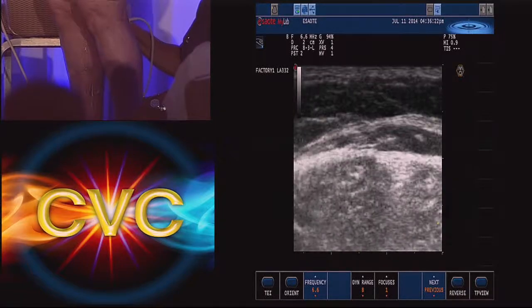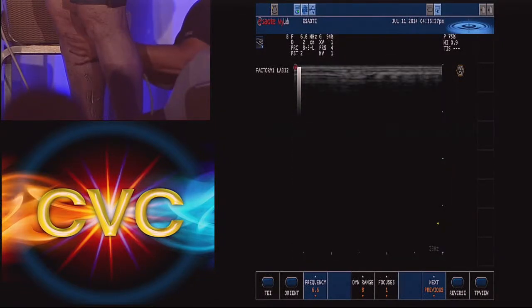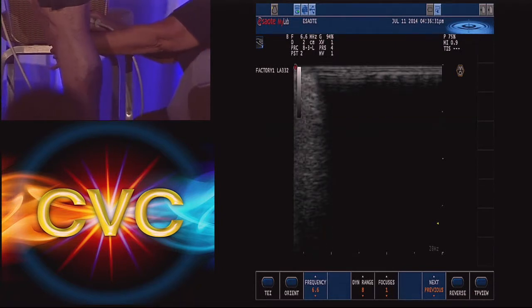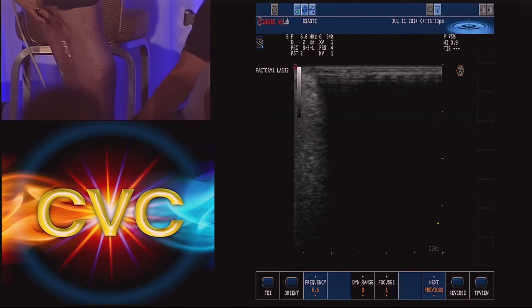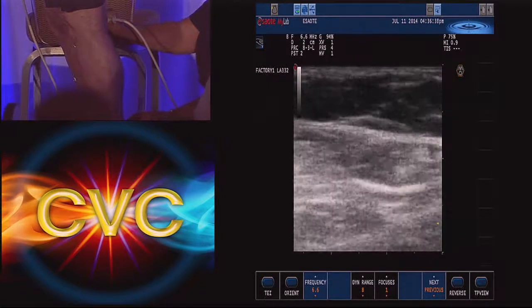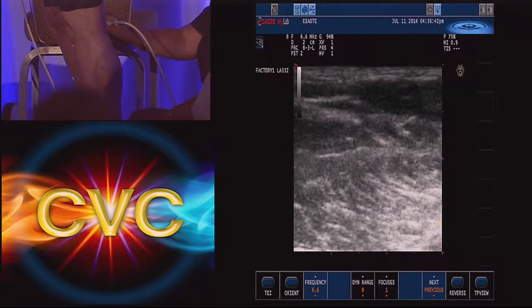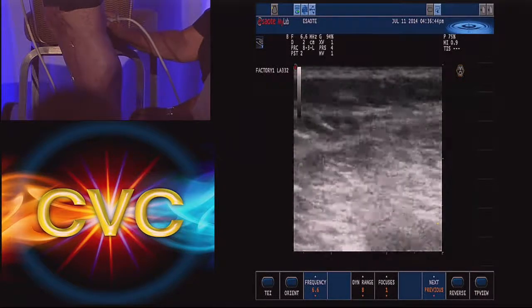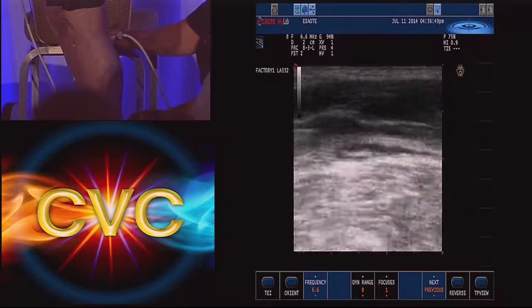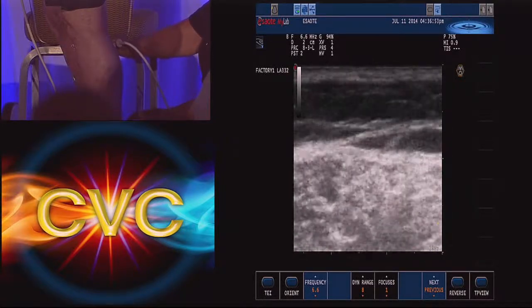No. It's actually pretty easy. The stretched vein, as long as there's some blood in it, will stay stretched. It just doesn't go back down to normal. But if there's no flow, it'll thrombose immediately. So let's say you shut this part, and this was the only part of flow going down, it'll shut down, it'll thrombose. So I have one patient I've seen so far who I did the saphenous, where this was the main source of all the reflux. She thrombosed everything because this was the main source of the venous hypertension. You don't have to do anything.